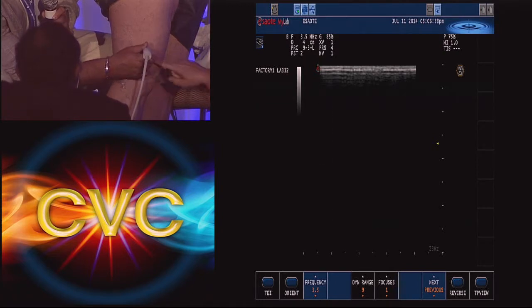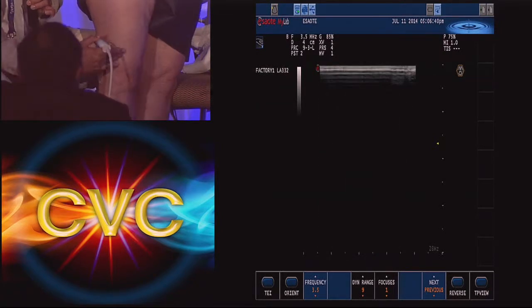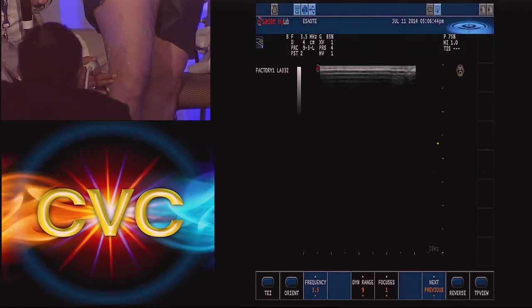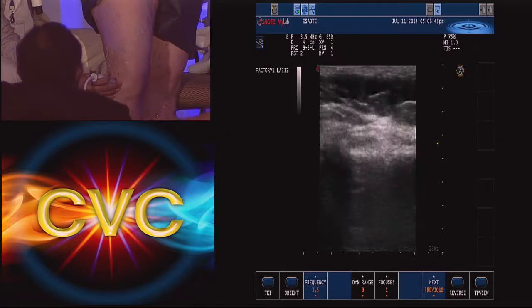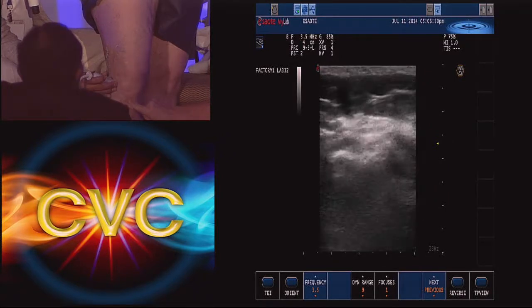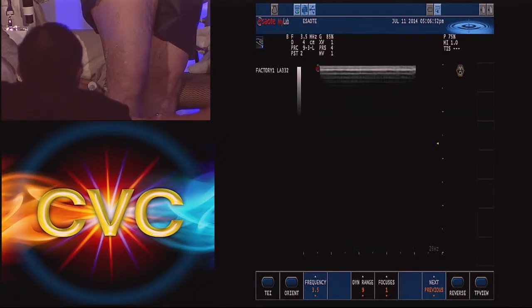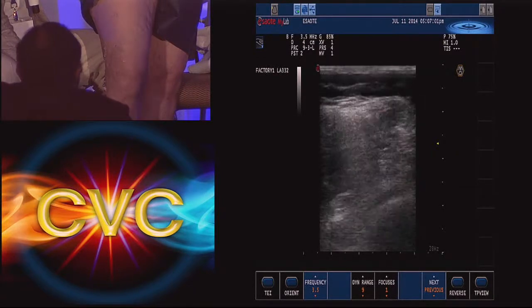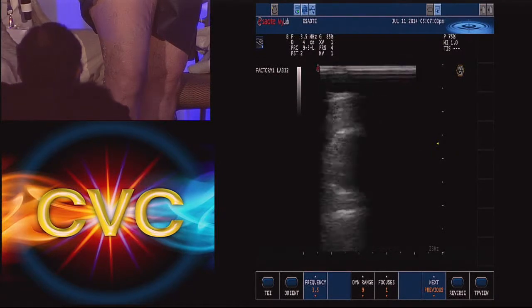See it right there. Okay. Yeah, you're good. So I feel my way through that, and I'm following it down further. So this one, lower down, I'm not that worried about a perforator here. I'm going to treat the upper GSV, treat this, and see what happens. If it persists, then I know there must be something else feeding here and follow it down.